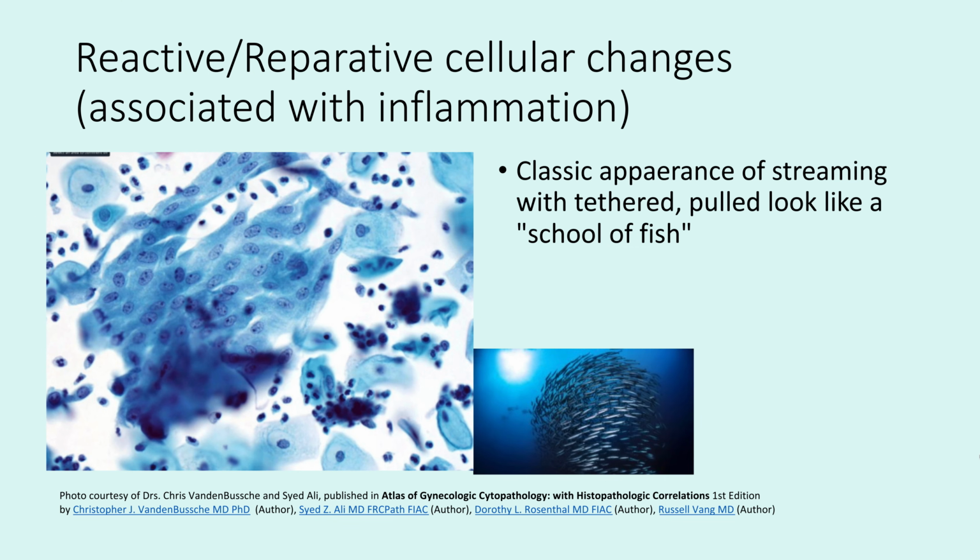In general, it can be associated with inflammation, physical or chemical trauma, and radiation, but like I said, the most common is associated with inflammation, and this is quote-unquote typical repair, like I said. And reactive changes can involve all different kinds, like glandular or squamous epithelium. If you see single cells, irregular nuclei, irregular chromatin, or variation in the size and shape of nucleoli, the repair is atypical and shouldn't be put in this category.